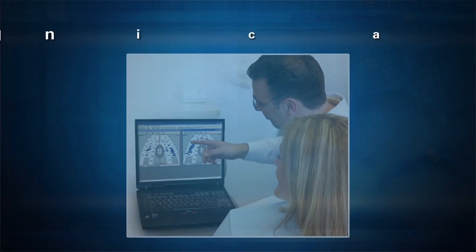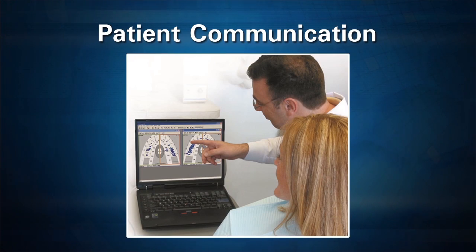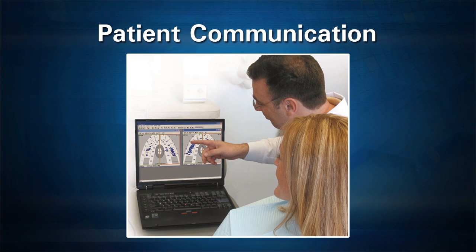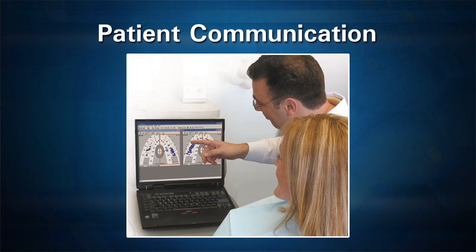The T-Scan is an excellent tool for patient education. The software allows your patient to see their bite on screen, which helps them to see potential problems and the need for treatment.